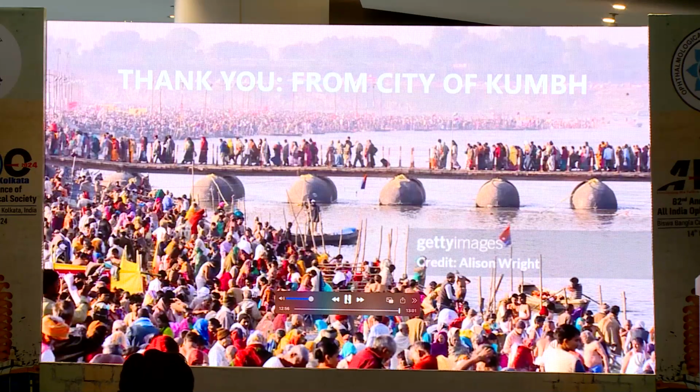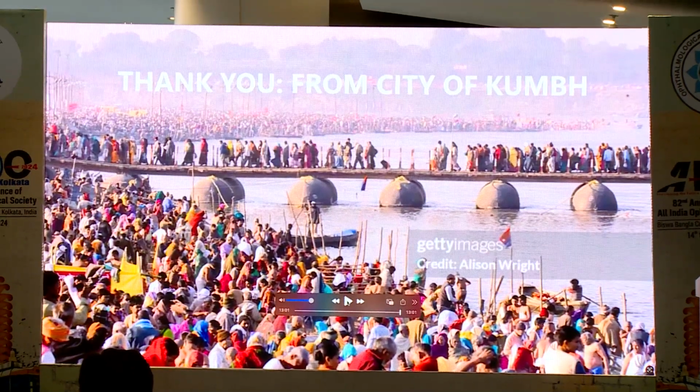The chronic inflammation is also less, because the lens is enclavated in the mid periphery, whereas with the scleral fixated lens, you have to go through the ciliary body. Then a lot of chronic inflammation may persist, which may lead to macular edema. It is more than with the retropupillary iris claw lens.